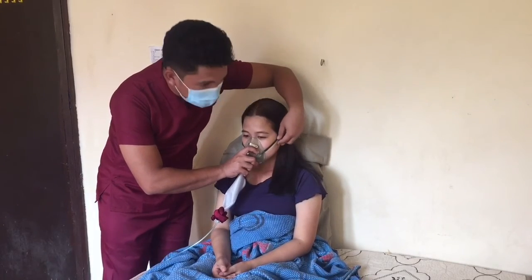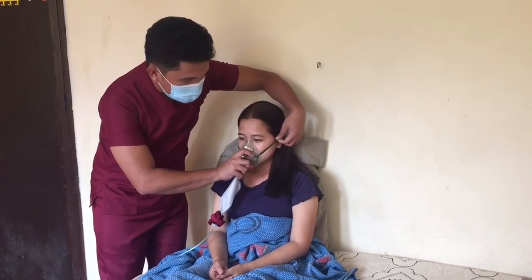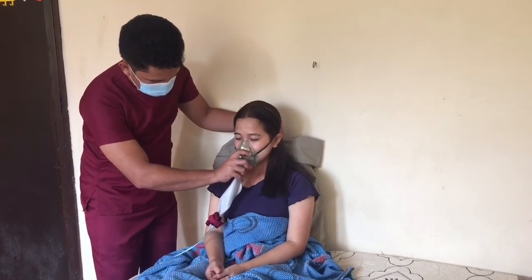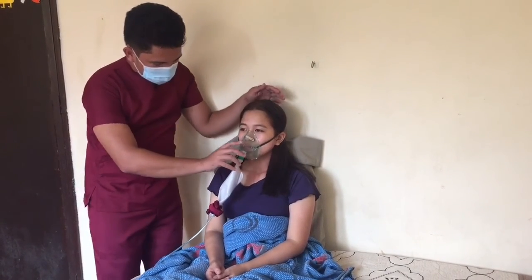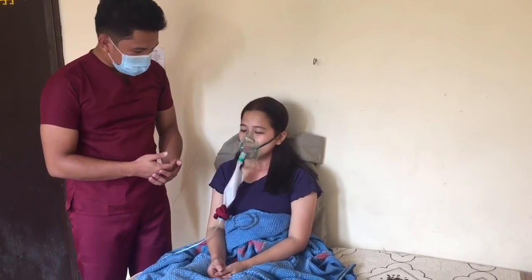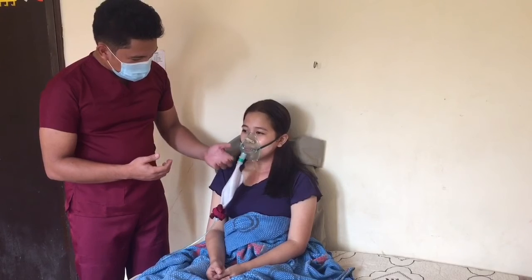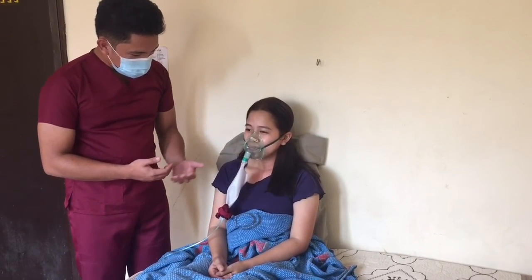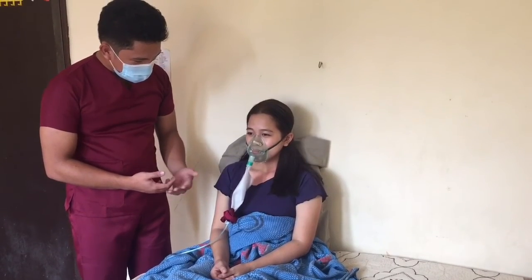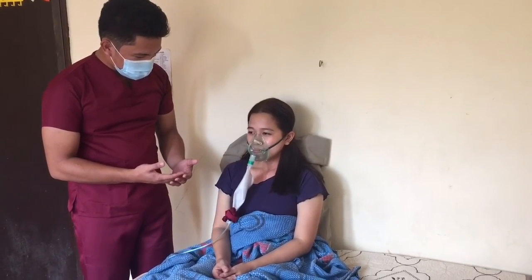And secure the elastic band around the client's head so that the mask is comfortable. So, okay na itong breathing, ma'am? Yes, nurse. Hindi po. Pwede po inhale, ma'am? Exhale. Inhale, ma'am. Exhale.